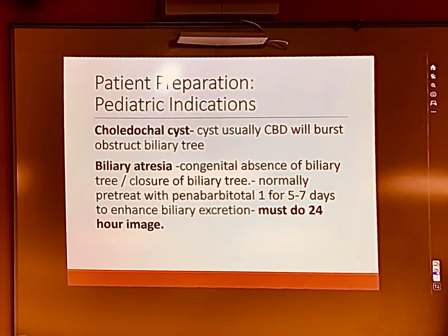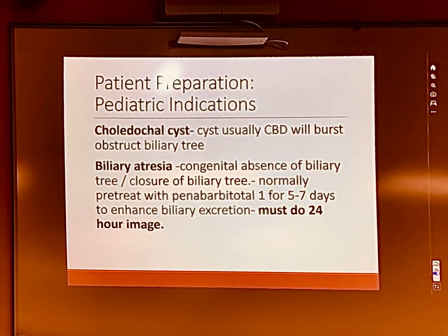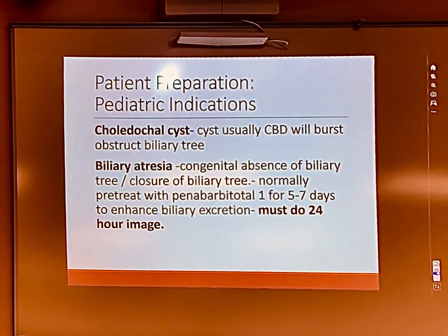Okay, so what we do is we pre-treat, well, we don't, the nurses do. We'll pre-treat these babies with phenobarbital, okay, for 5 to 7 days to see if they have any biliary tree at all, to try to force if there's anything that's maybe just collapsed, right? So we can't see it because it's completely collapsed. To try to enhance that biliary excretion to see if we can force anything open, okay? So a biliary atresia image is 5 to 7 days with phenobarbital, inject, scan the next day.